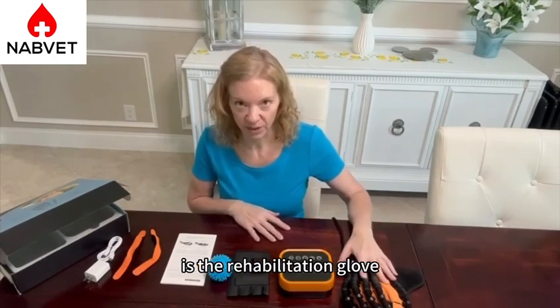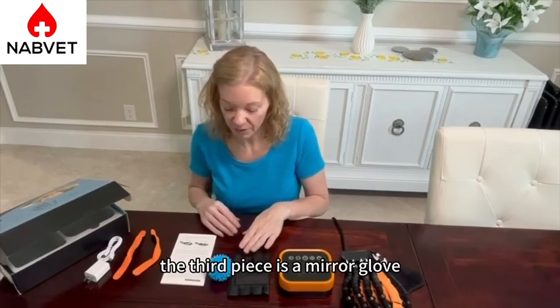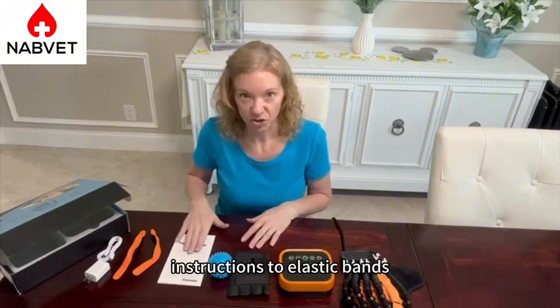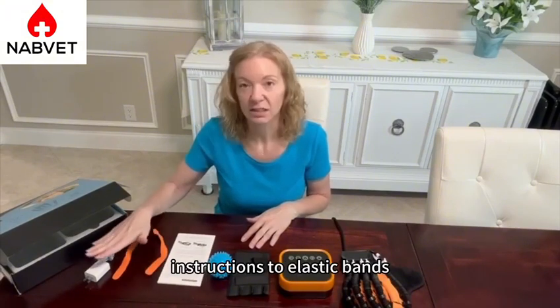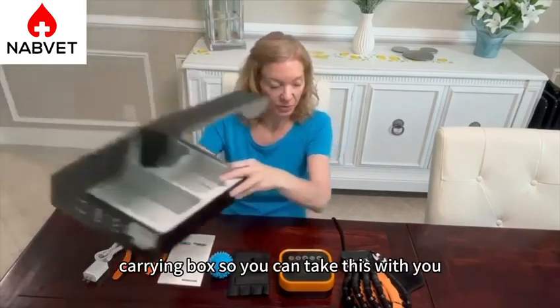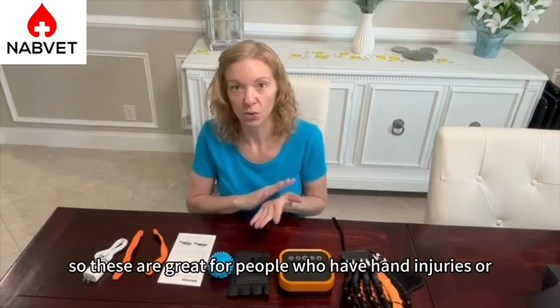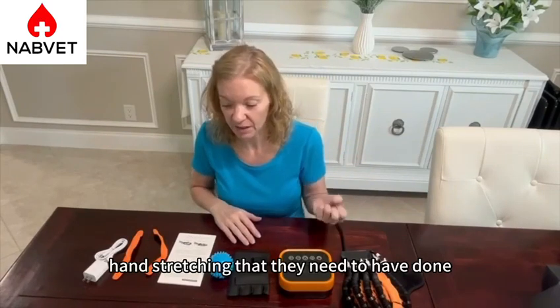The first thing you're going to get is the rehabilitation glove. The second piece is called the host. The third piece is a mirror glove. You have a training ball, instructions, two elastic bands, your charger, and then your carrying box so you can take this with you. These are great for people who have hand injuries or hand stretching that they need to have done.